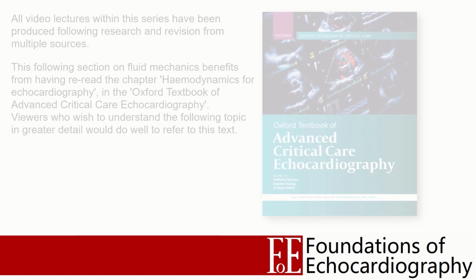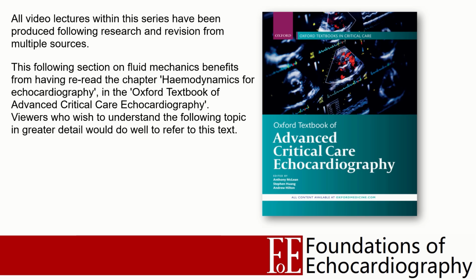Now that we can produce spectral Doppler graphs, we need to learn what information this tool can provide us about a patient's circulation. This involves discussion of some of the physics that govern fluids in motion. Now, I'm a clinician working in critical care and not a physicist or a physiologist, and so I only intend to scratch the surface of some of these concepts. As is the case in all of the lectures, the following models will be gross oversimplifications, but I hope that they provide insight that allows you to understand why we can apply these techniques at the bedside.